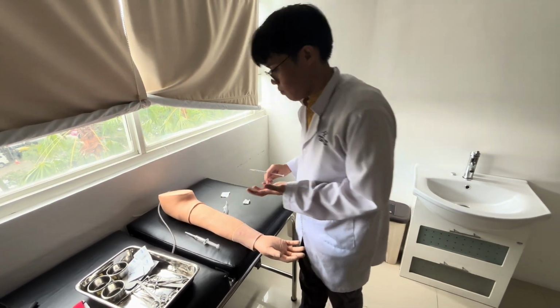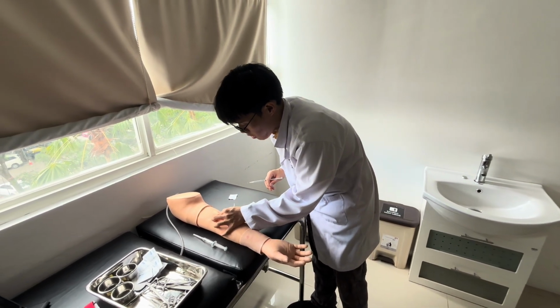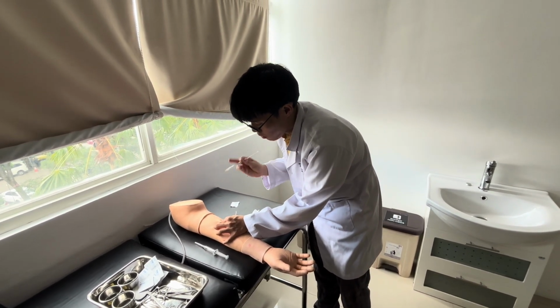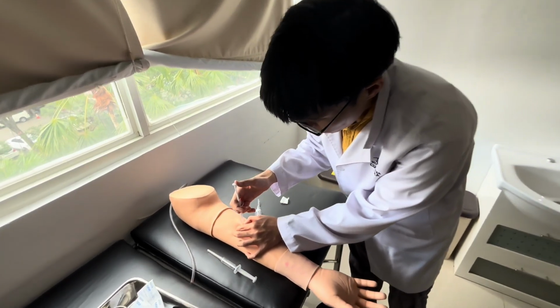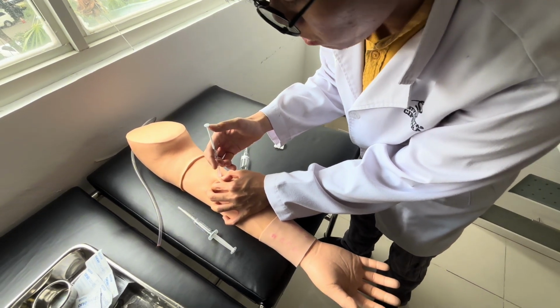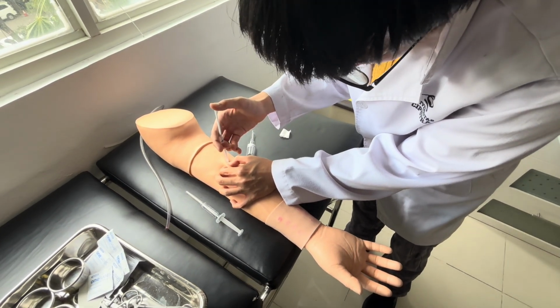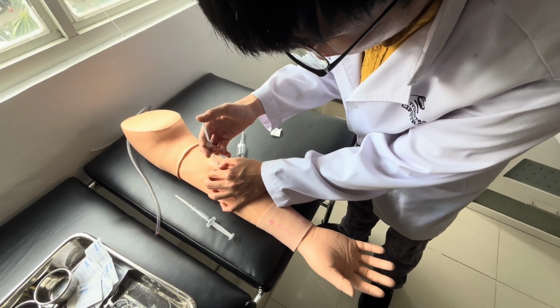And what we'll do is, using your gloved hand, you will pinch the area. So pinch it kind of hard like this. And since the needle is very small, we can do it at 90 degrees. So just insert it immediately. And then do aspiration to make sure no blood is seeping out. And then just inject it slowly. 1 milliliter, 10 seconds approximately.